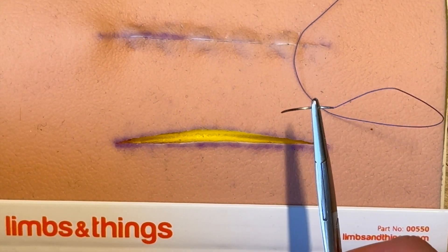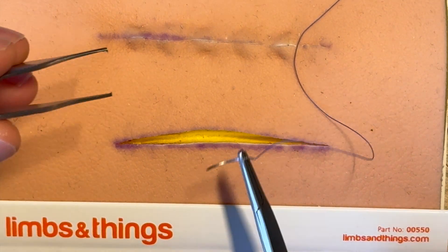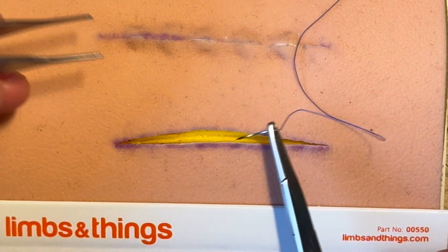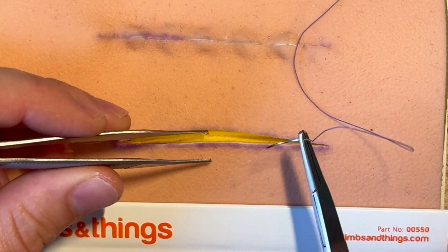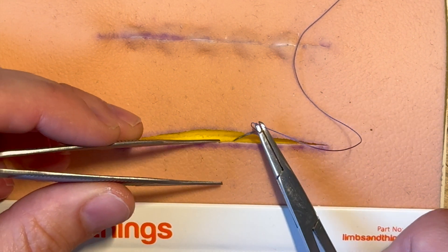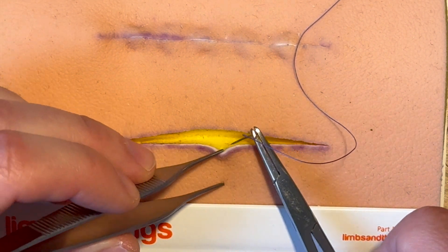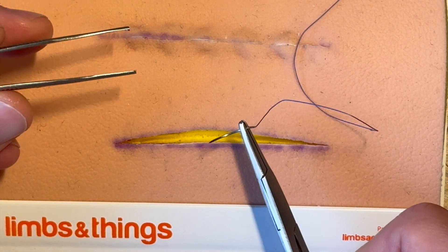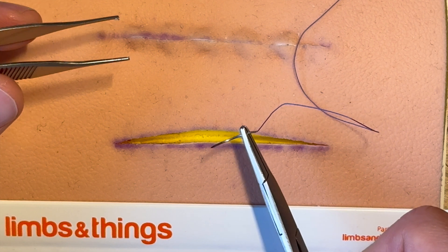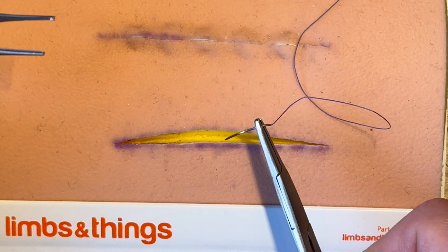We're going to use either the skin hook or the forceps to approach the cut wound. We'll start in the middle, because typically that's what you do, then add other ones. We're going to do this buried stitch — it's going to be underneath the skin. When you're trying to remember how to place it, remember the knot at the end should be as deep as possible.